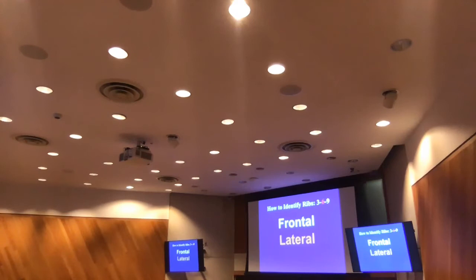What procedure do we do on the lateral chest wall? That's where you do a chest tube. How are we going to count the ribs? Here we say this is my second rib, corresponding to this protuberance. The one below is third, and the one below is fourth. I keep going down, and laterally I get fifth, sixth. There's no separate way to count the first rib in the axilla because there's too much tissue. So we go from the front and keep going down: third rib, fourth rib, fifth rib, sixth rib.